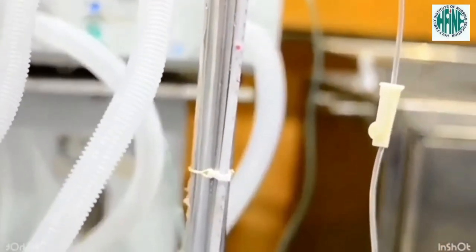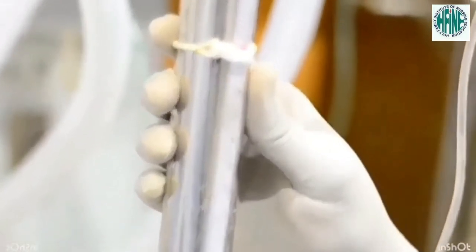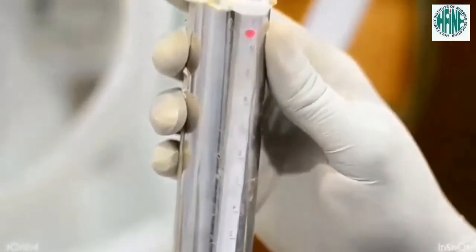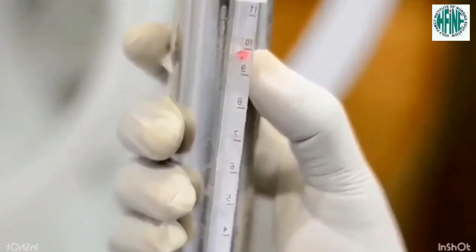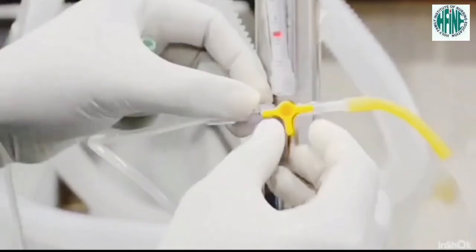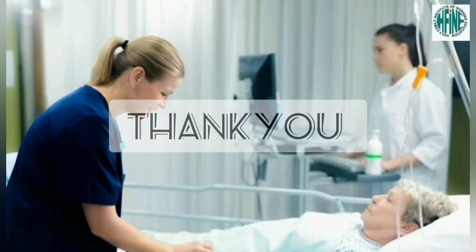The normal CVP pressure is between 5 to 10 cm of water, or 0 to 6 mmHg. Turn the stopcock off towards the manometer. Reposition the patient and make him comfortable. Wash hands and document the reading. Thank you.